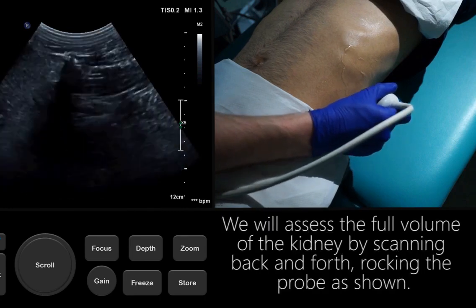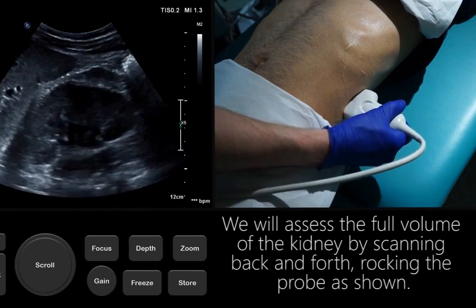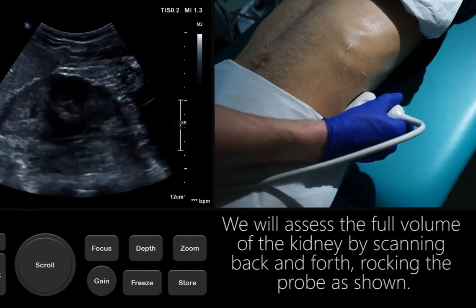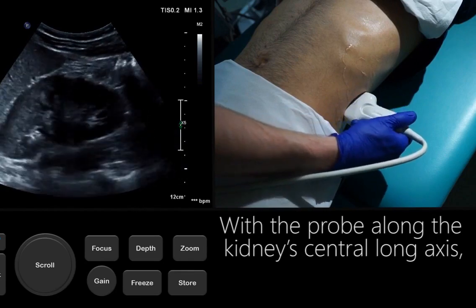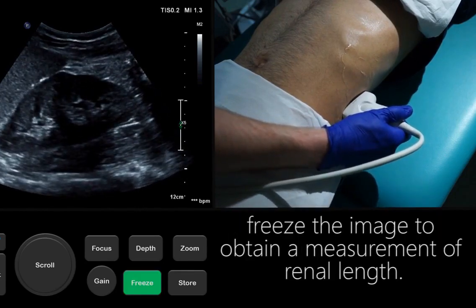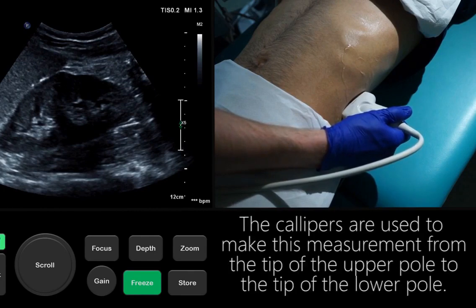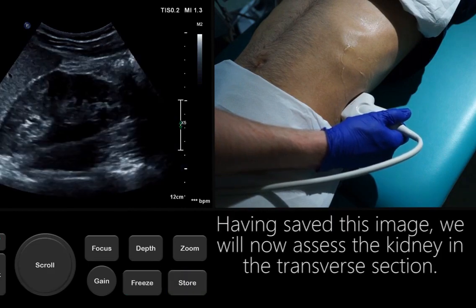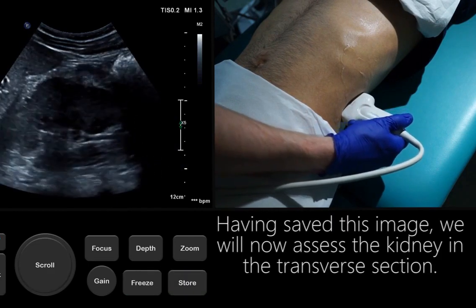We will assess the full volume of the kidney by scanning back and forth, rocking the probe as shown. With the probe along the kidney's central long axis, freeze the image to obtain a measurement of renal length. The calipers are used to make this measurement from the tip of the upper pole to the tip of the lower pole. Having saved this image, we will now assess the kidney in the transverse section.